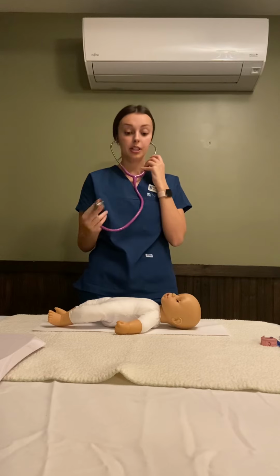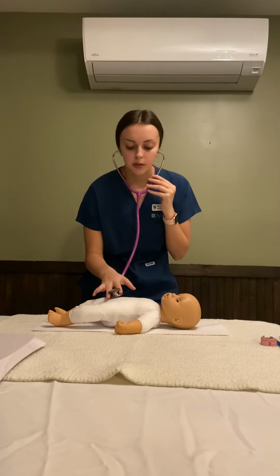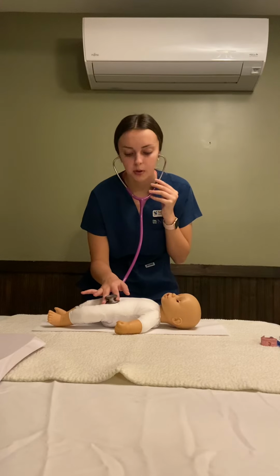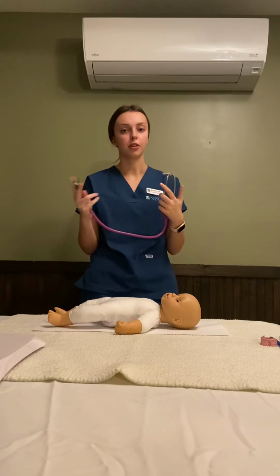And then I'm going to keep my stethoscope because I'm going to be auscultating the bowel sounds. So we're going to start in the right lower quadrant and go to the right upper, to the left upper quadrant, and down to the left lower quadrant. And then if there's no sounds present, you should listen for a full 5 minutes in each quadrant.